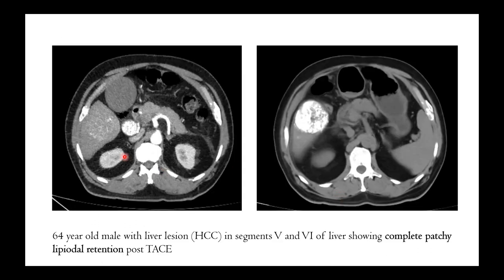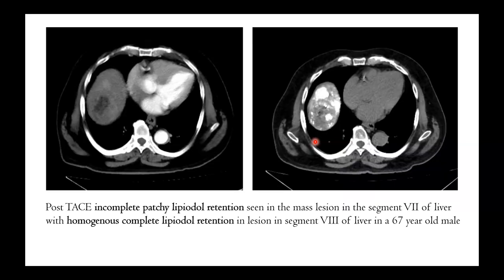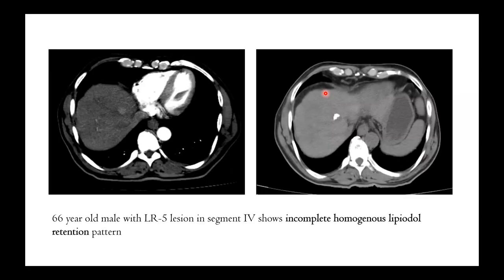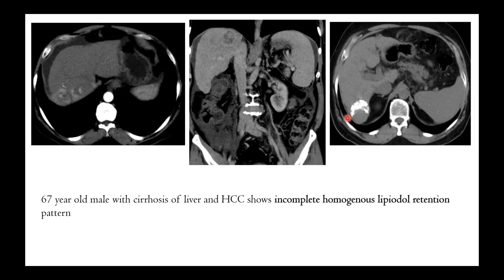Here we can see a 64-year-old male with an HCC lesion in segments 5 and 6 showing complete patchy lipiodol retention post-TACE. Another case shows incomplete patchy lipiodol retention in a large lesion, whereas a smaller lesion adjacent to it shows complete homogenous lipiodol retention. A 66-year-old male with an LR5 lesion shows incomplete homogenous lipiodol retention. A 67-year-old male with cirrhosis and HCC shows an incomplete homogenous lipiodol retention pattern.